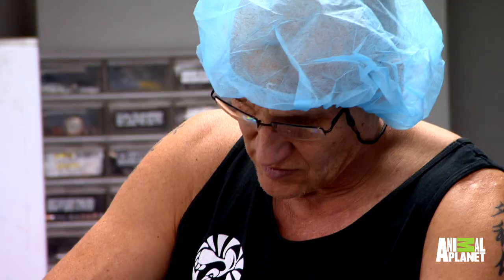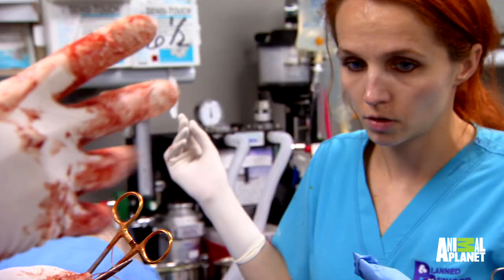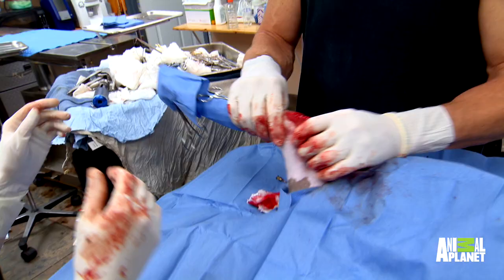So pick the dog up by that. That's good. Petra, do a gloving and crimp for me. I think that's it. I like the way it pulls. Push it down hard. This is scissors. Perfect.